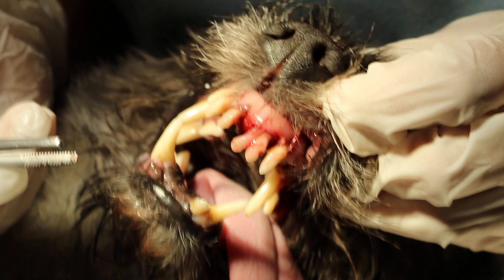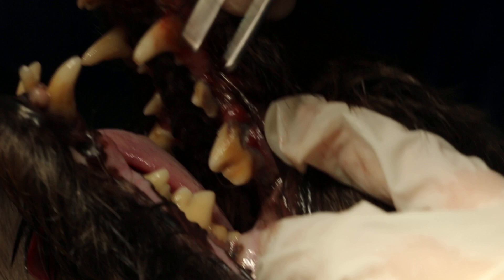Then the other side — you can also see the exposed roots. Let me get some light. Exposed root. Put a bit of light here.